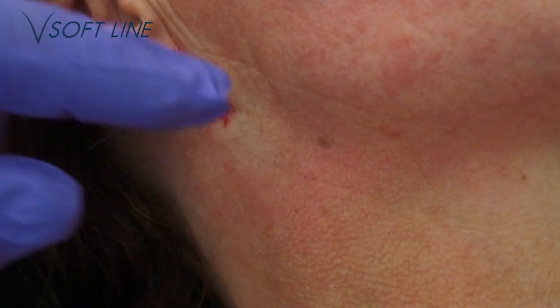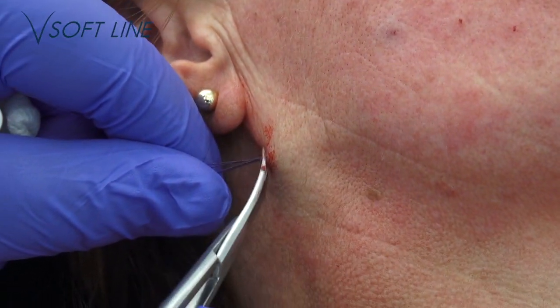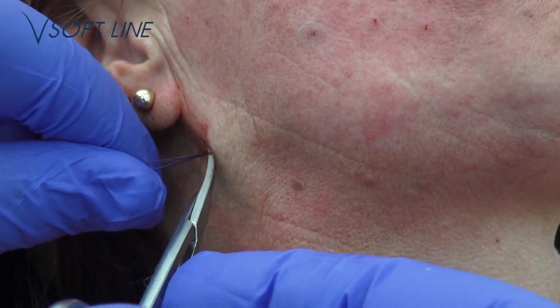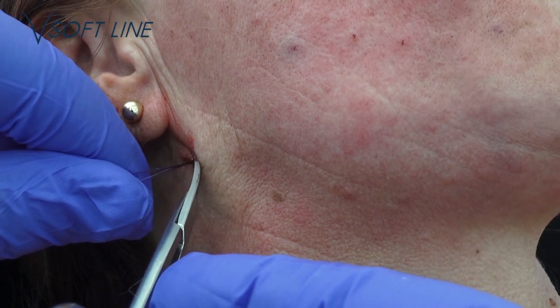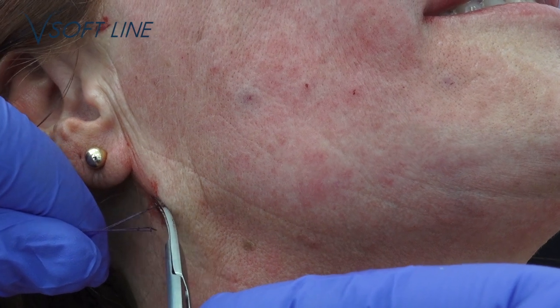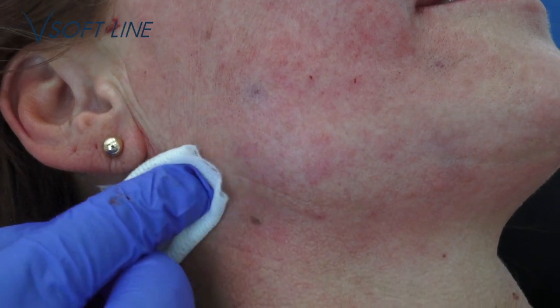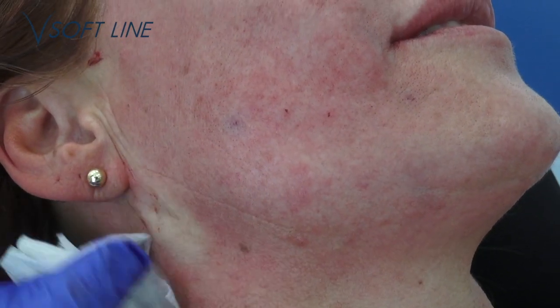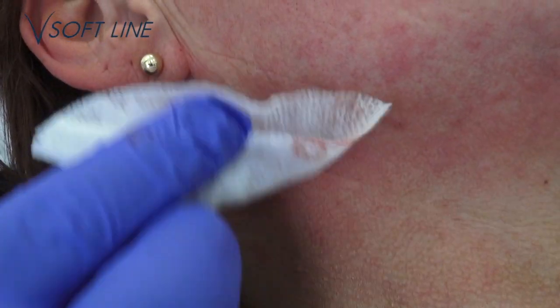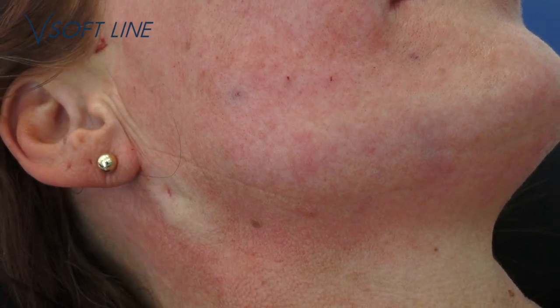Now we do the finishing, cutting the sutures close to the skin, pushing down the end a little. Be careful not to cut the skin. Pull the skin over the entry hole here. There. To avoid getting a dimple like this one, you see it there quite clearly. Voila, you see the effect immediately.